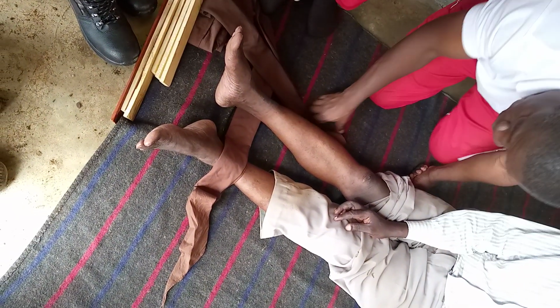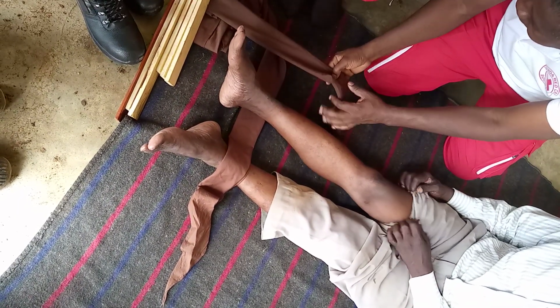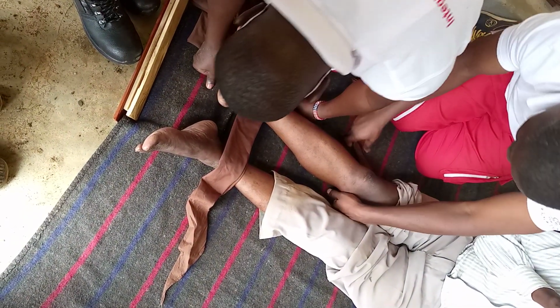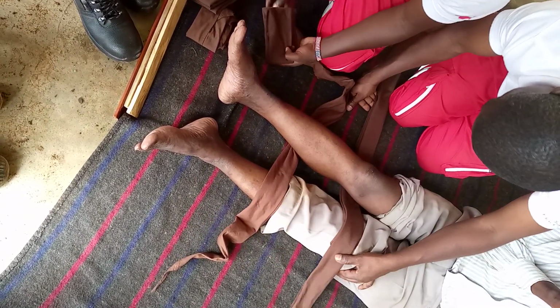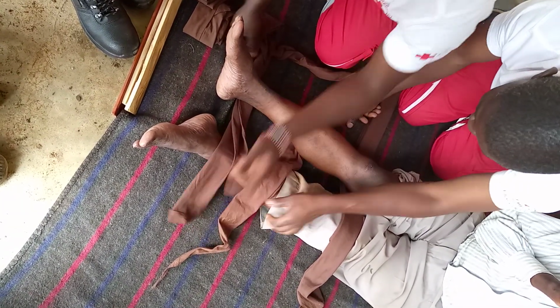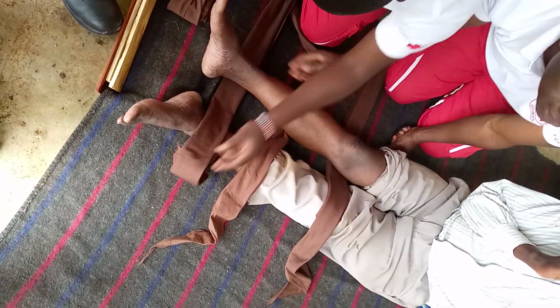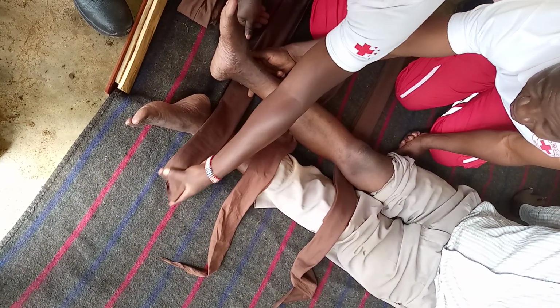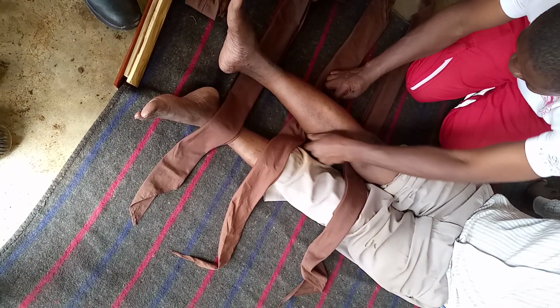So we are going to immobilize this fracture. Are you seeing? So, are you observant? Do you know why we are taking this through these points, these places? We don't want to lift this leg because it is already affected, and we have to use these natural openings. You fix it there, then slowly pull it to where you want it. Have you seen?